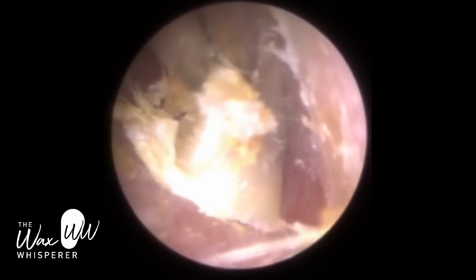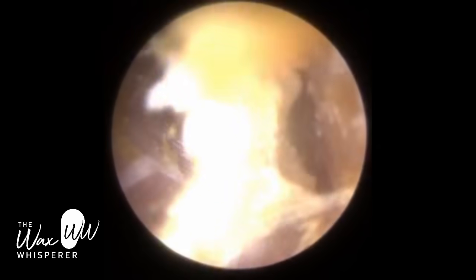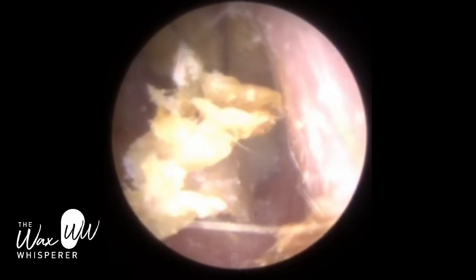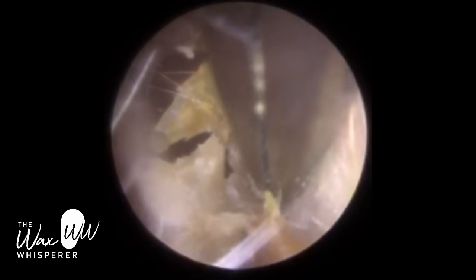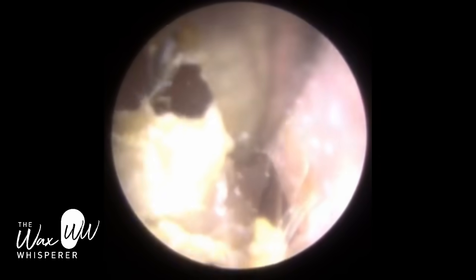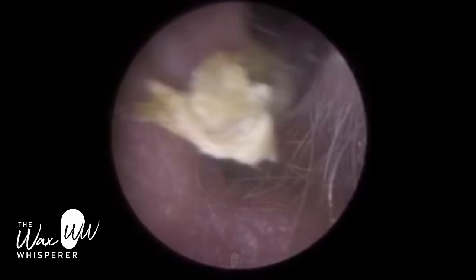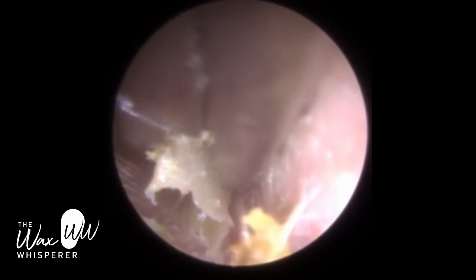Whenever you remove dead skin - keratin - unfortunately you do get some blistering, and you'll see that. The patient will have some blistering at the end of the procedure on the base of the bony part of the ear canal and also some on the anterior canal wall. So if you pull some dead skin off your finger, for example in winter, we often get dry skin and you peel that, you also get blistering on your finger. It's completely painless for the patient. I did ask him on a couple of occasions whether it was okay, because I was really tugging at this, and the patient was absolutely fine - he was actually quite enjoying it, he found it therapeutic. But yes, it can cause some blistering.